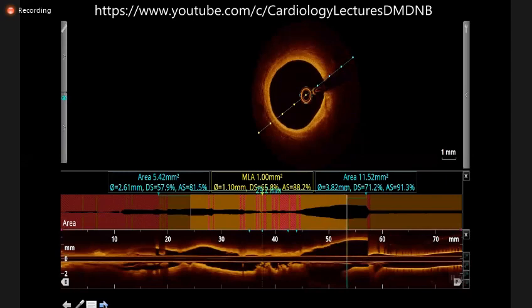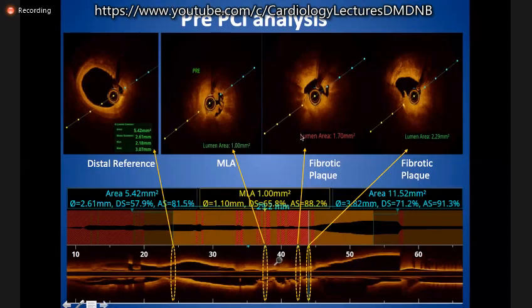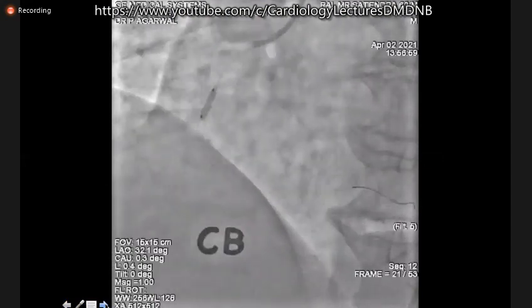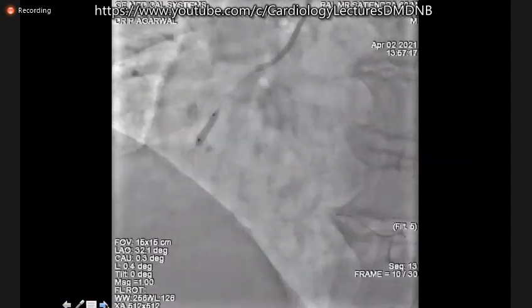So seeing that fibrosis, we've taken some measurements. If you see, distal is about 2.61, proximal is about 3.82. And we can see these pictures with thrombus sitting here, all fibrotic areas sitting here. So now it's again a cutting balloon. It's an optimally sized cutting balloon, around 3.0, at about nominal pressures, about say 12 to 14 atmospheres, and a good cutting all around.